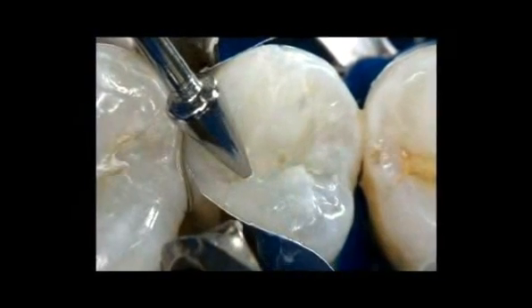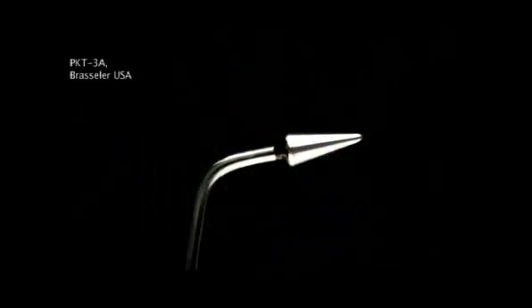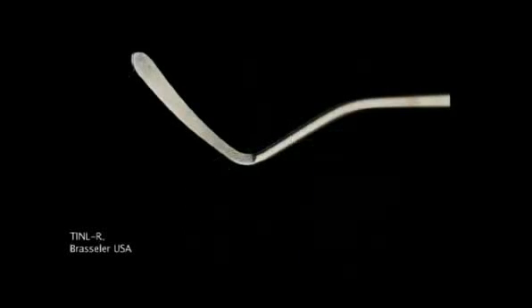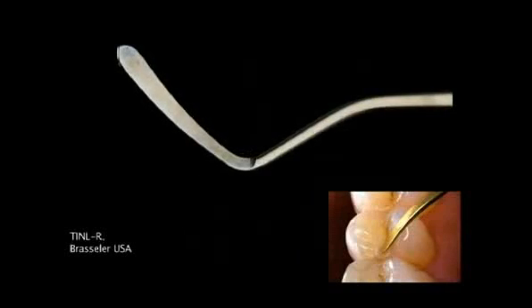The occlusal anatomy is contoured and developed with a pyramidal-shaped instrument, a Peter K. Thomas 3A by Brasseler USA. Another instrument that facilitates this process is a curved instrument, TINL-R by Brasseler USA.